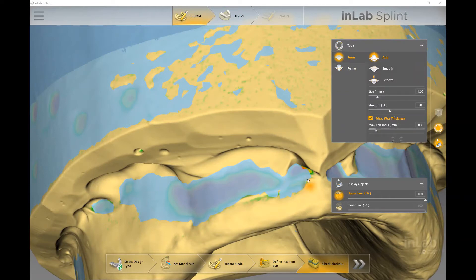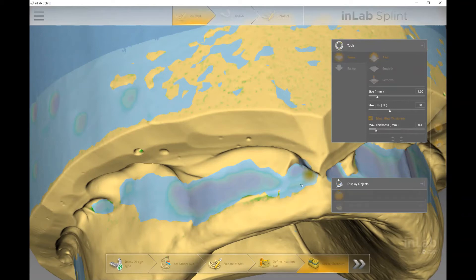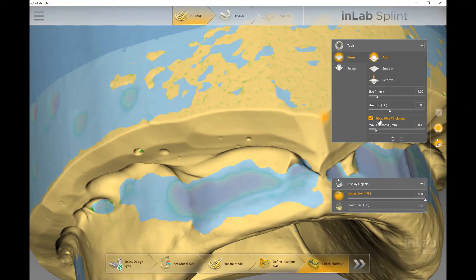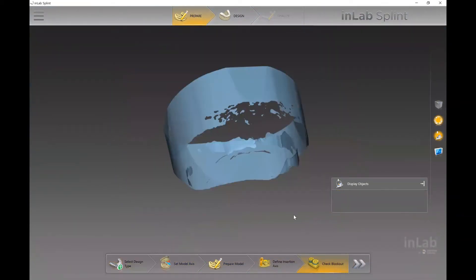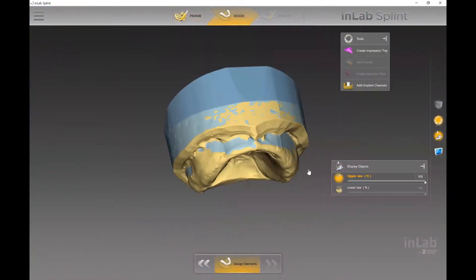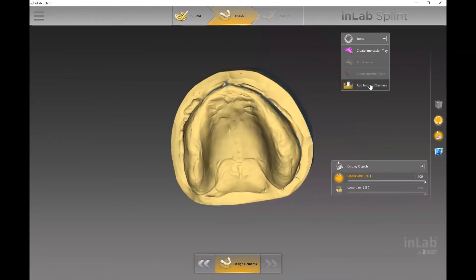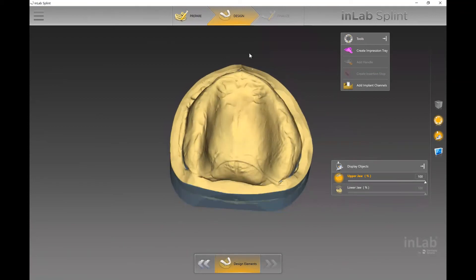With the form tool you can add, smooth, or remove block out material. You can also take it a step further by identifying your max wax thickness — basically telling the software that when adding block out, you don't want it going past 0.4 millimeters. This adds a safety limit so the software won't overdo how much block out it's placing for you. That's the nice added benefit of the block out tool.